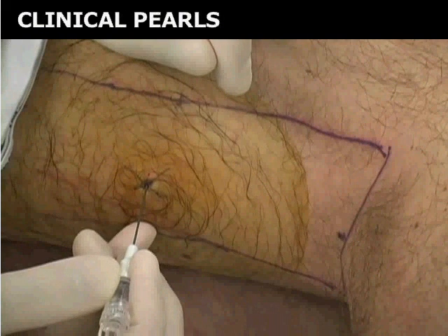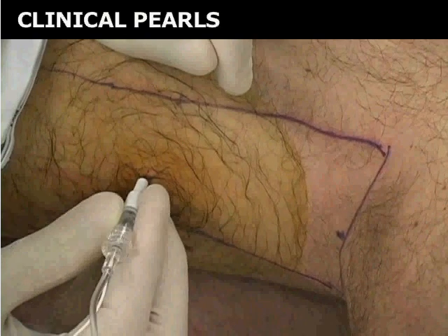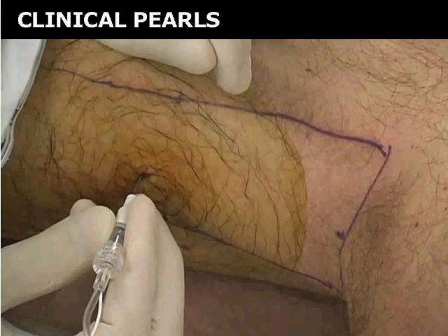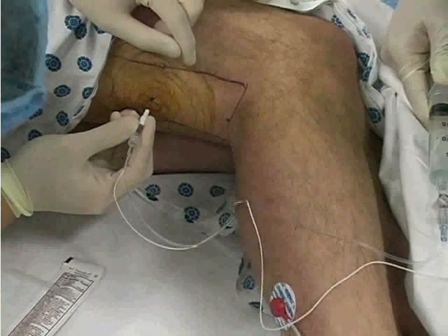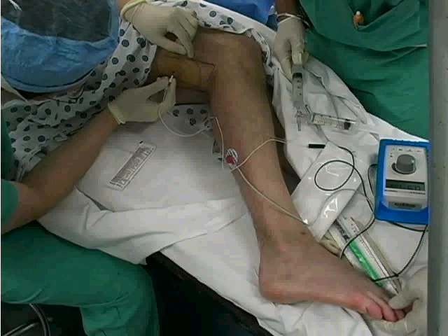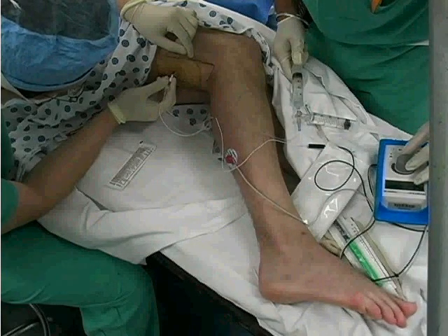As the needle penetrates the skin and subcutaneous tissue, local muscle stimulation may be achieved. If this occurs, gently pull the needle back and redirect it away from the previous path. As the needle is inserted, continue to watch for appropriate muscle stimulation, including calf twitching and toe flexion. When appropriate muscle stimulation is achieved, the amplitude of electrical current is decreased.